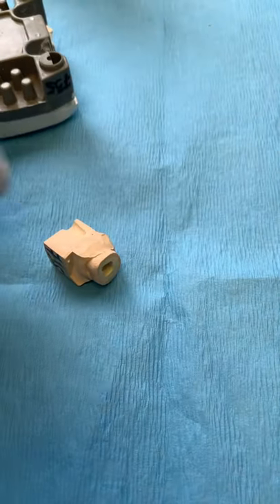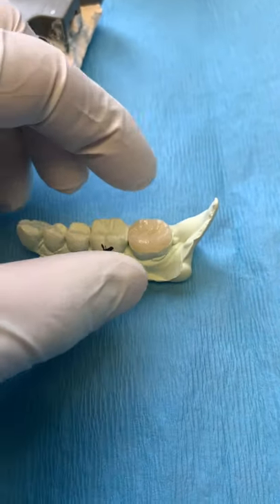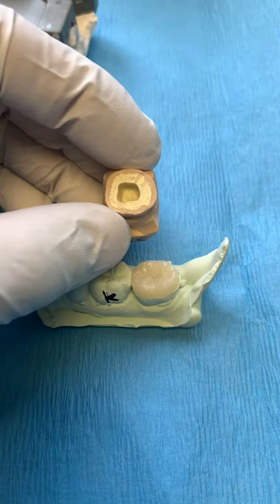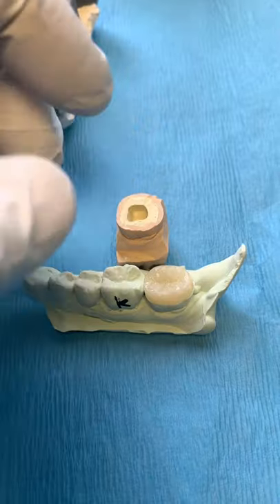So what's an endocrown? It's essentially using lithium disilicate material and using the internal surface of the pulp chamber to act as retention. So we still have enamel all the way around — amazing bonding — and then we're going to use a resistance retention form as the inside of the pulp chamber.